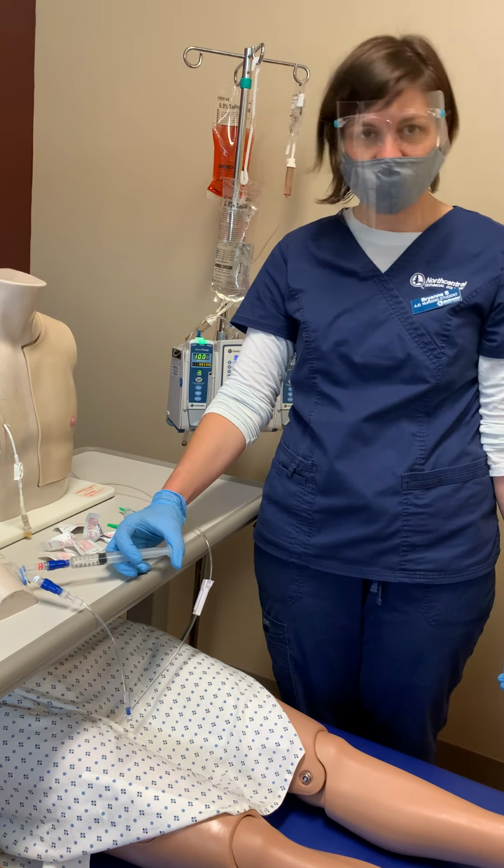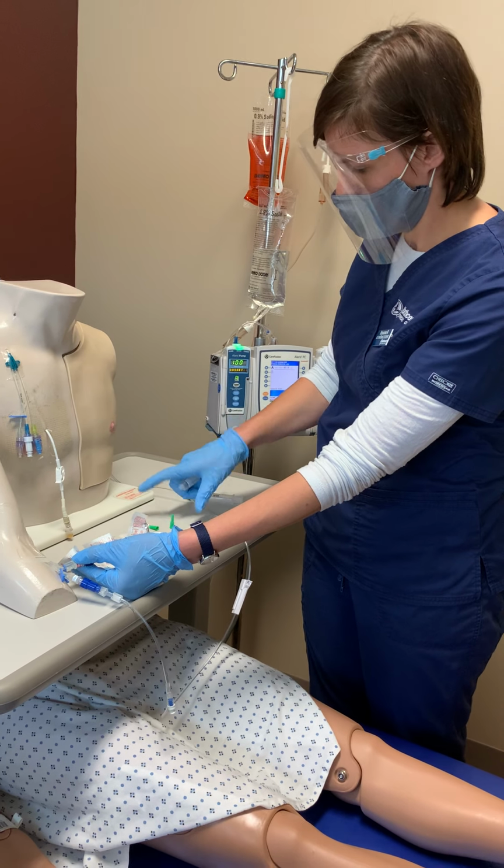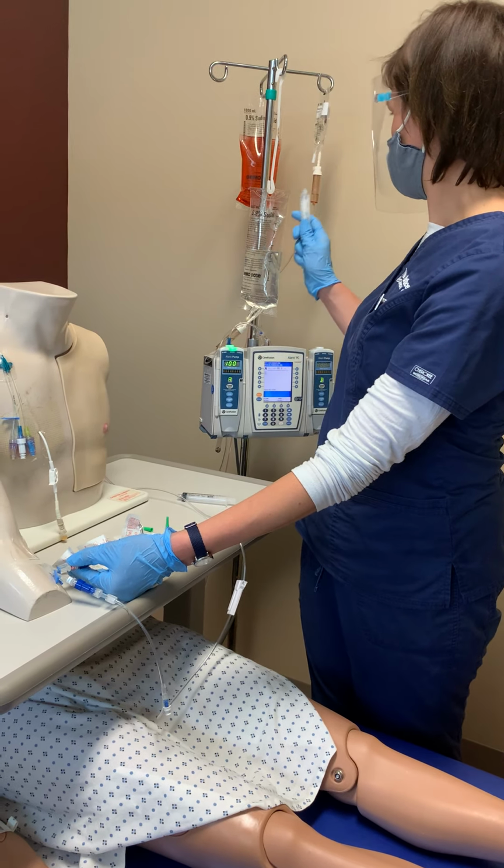And one more flush that I'll pulse all the way through. 15 seconds, letting it dry. No air bubbles. Also, none of my saline flushes were expired either. Okay, and pulsing.